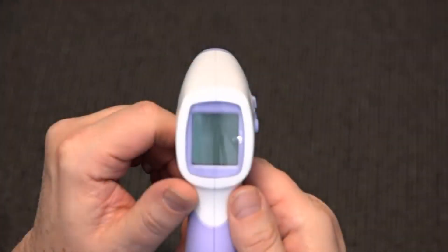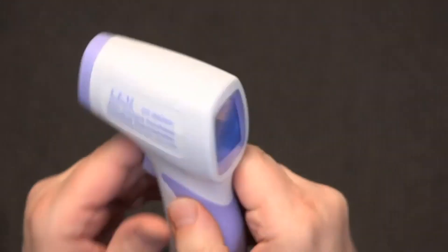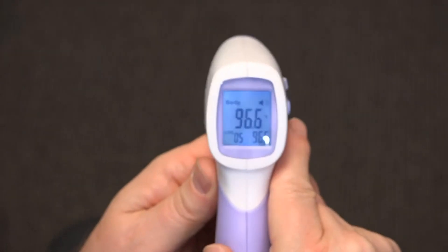Take the temperature of the same person using the uncalibrated non-contact infrared thermometer, keeping the measurement distance between 2 and 5.9 inches. Record the uncalibrated temperature of the non-contact infrared thermometer.